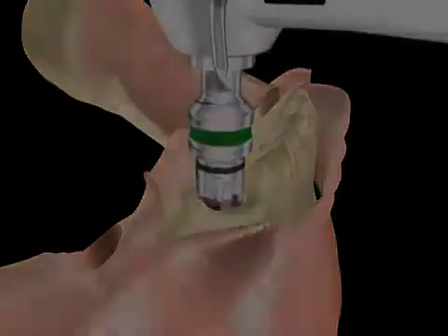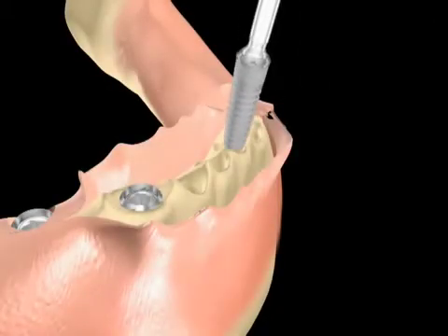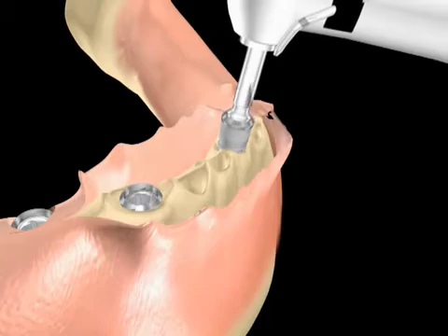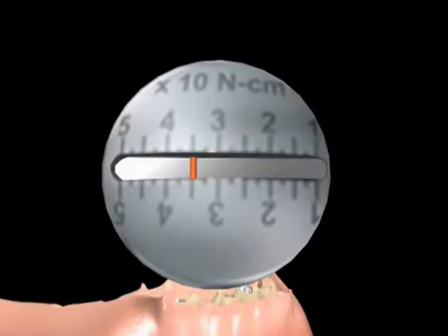The case is now ready for the implants. They can be fully seated through the use of a motorized attachment limited to a maximum torque value of 40 newton centimeters. If additional torque is required, a surgical ratchet wrench or a torque lock wrench can be used.